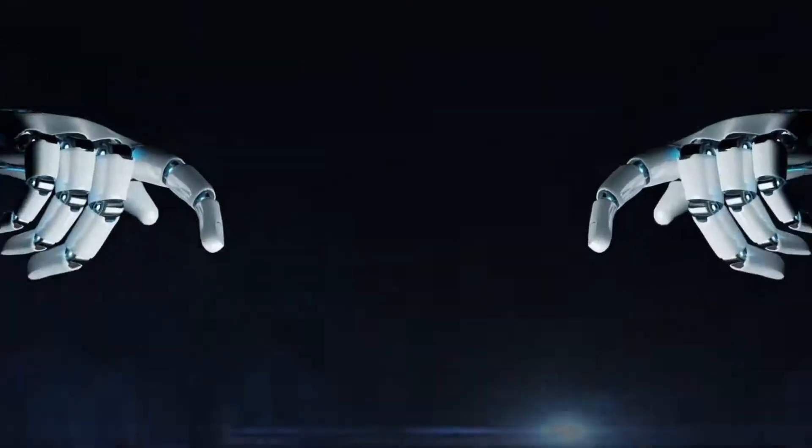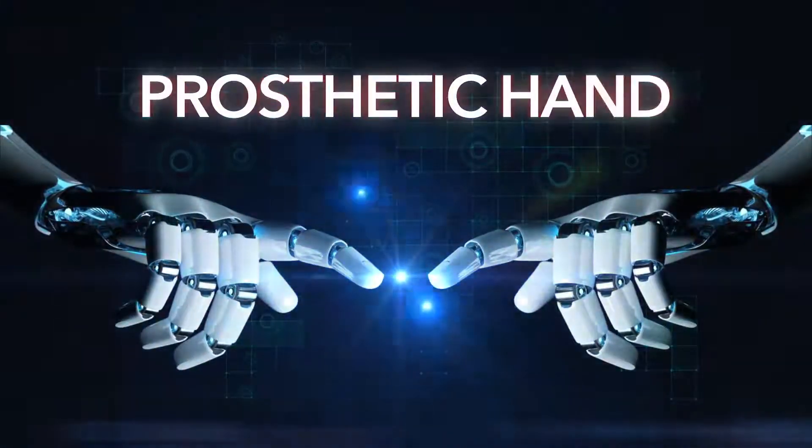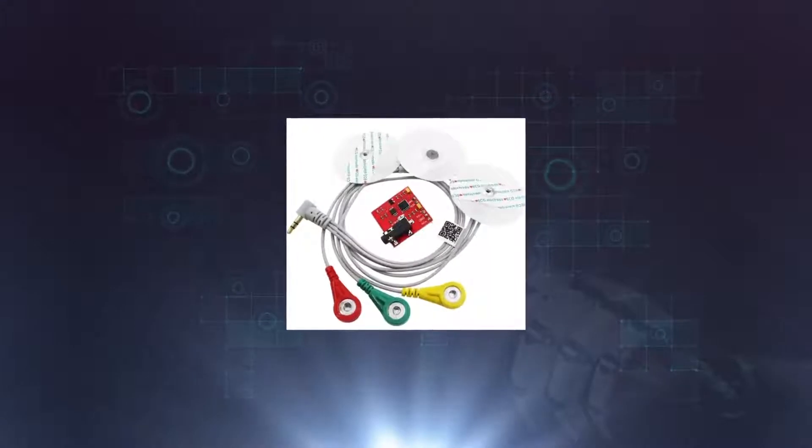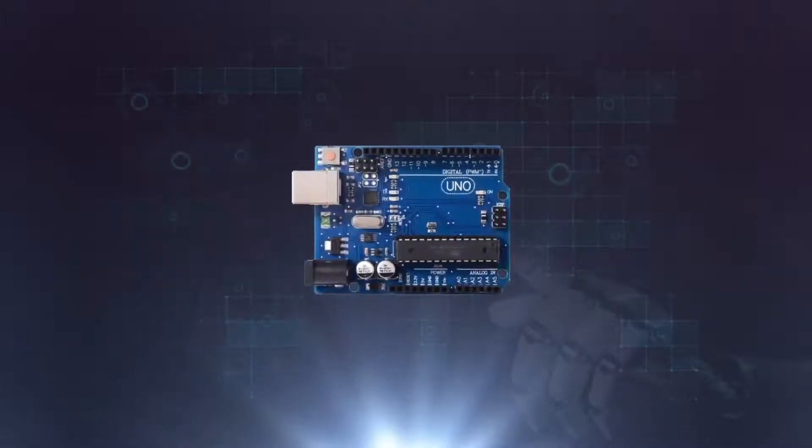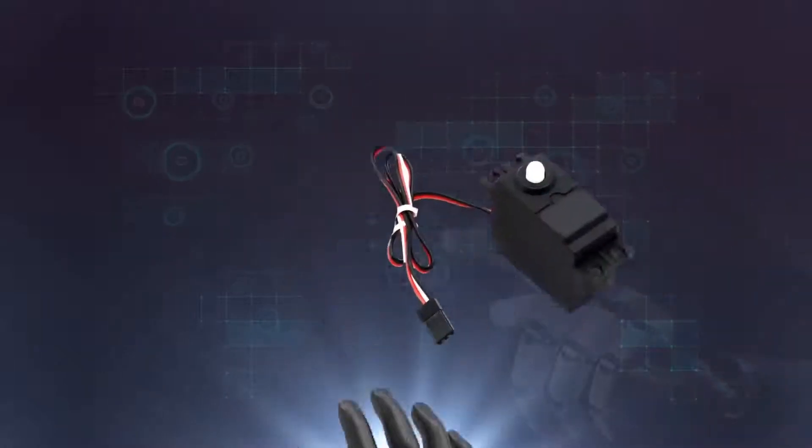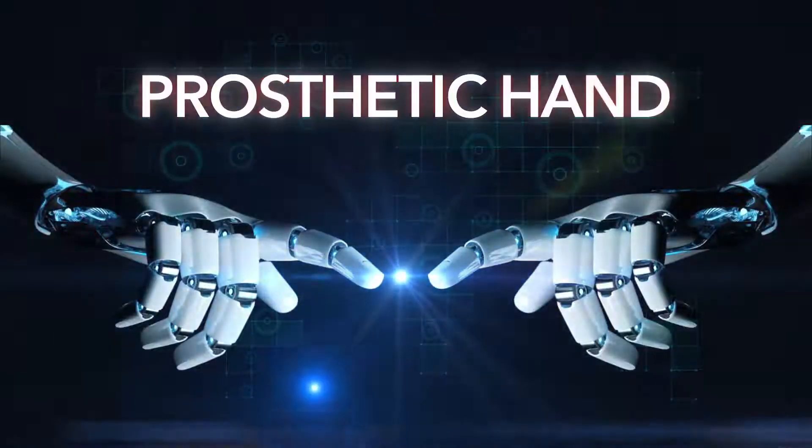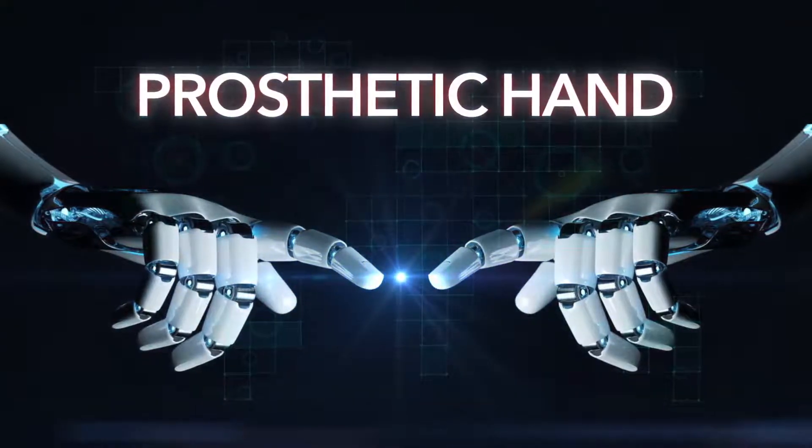Now let's look at the main components of this project. We need an EMG sensor with electrodes, two Arduinos, two Bluetooth HC-05 modules, a prosthetic hand, four servo motors, and two 9-volt batteries.